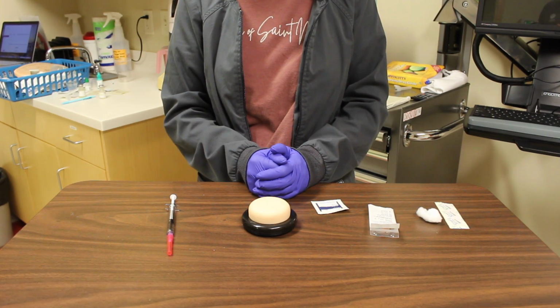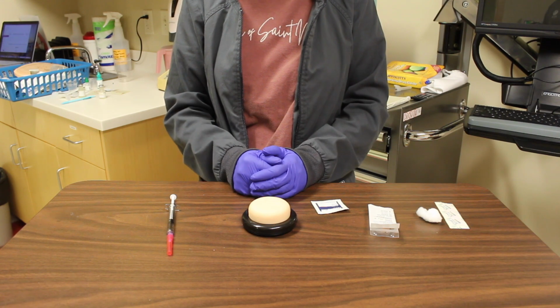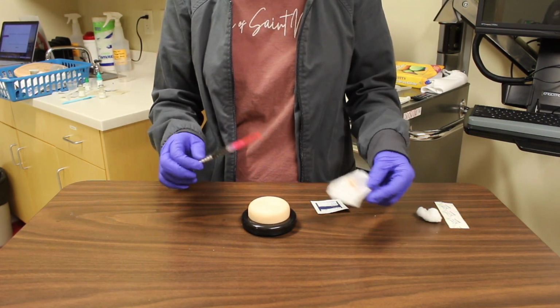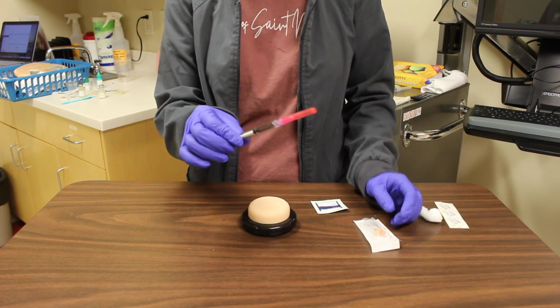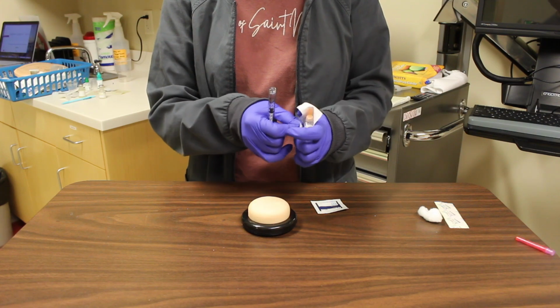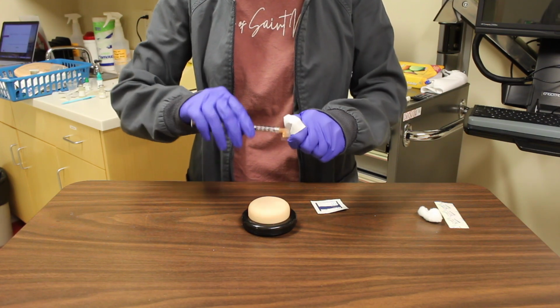Select the appropriate syringe and needle size. This will depend on the patient size as well as the medication being administered. Draw up the medication. Make sure that this is the correct medication and dosage for the patient, and do not give more than 1 milliliter of the medication in one particular site.